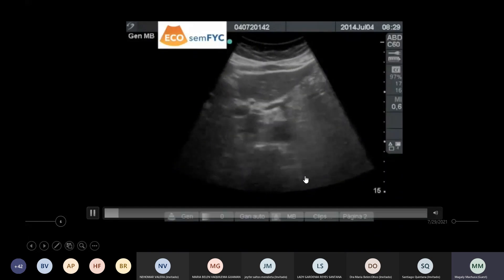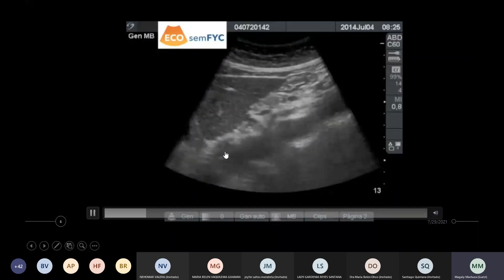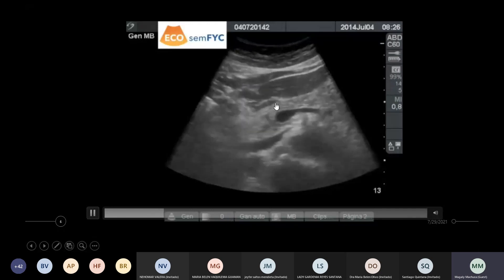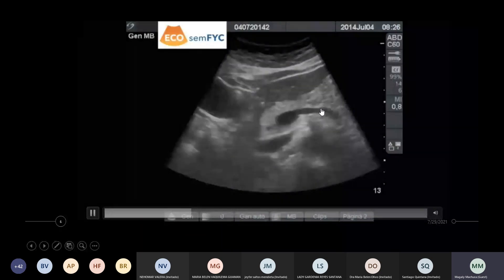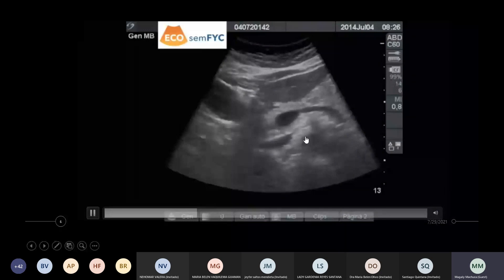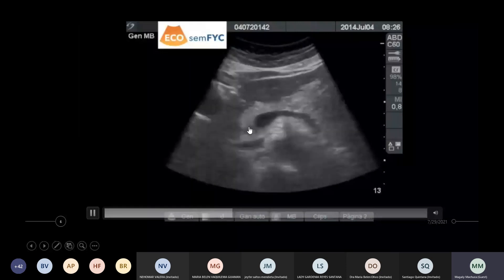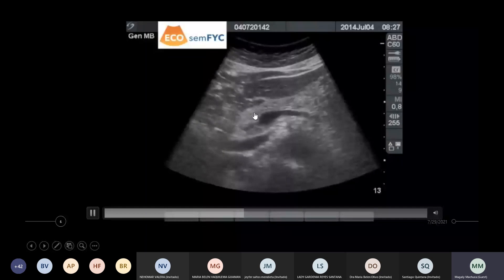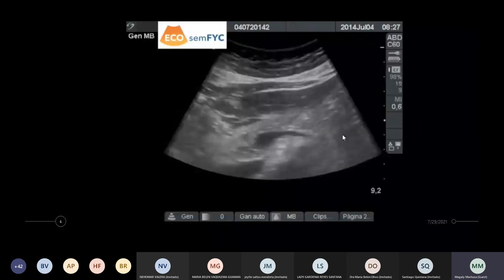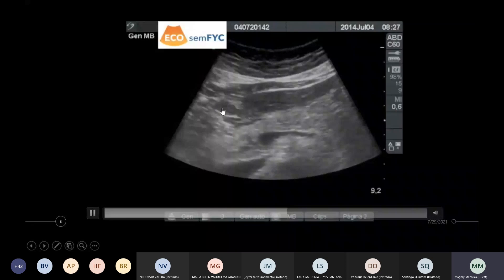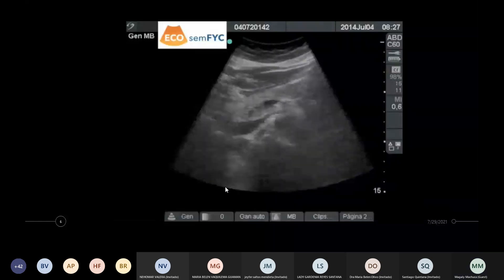Aquí en cambio vamos a ver el páncreas. Recordemos que el páncreas estaba relacionado con la segunda porción del duodeno y era un órgano retroperitoneal. Aquí estamos viendo el páncreas, la cabeza del páncreas, el cuerpo y parte de la cola. Recordemos que como referencia tomamos también la vena esplénica. Aquí tenemos la aorta y aquí está la cava. Aquí vemos en toda su extensión el páncreas: cabeza, cuerpo y la cola. Así deberíamos ver el páncreas, y estaría relacionado también con las porciones del duodeno y el lóbulo izquierdo del hígado.